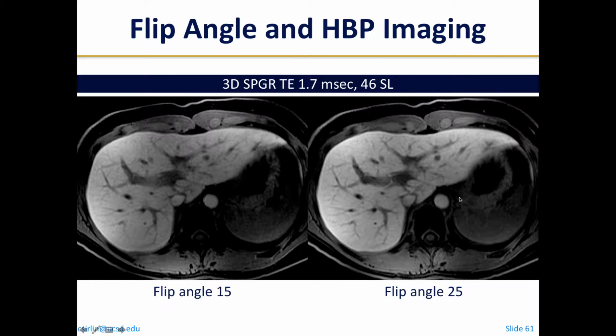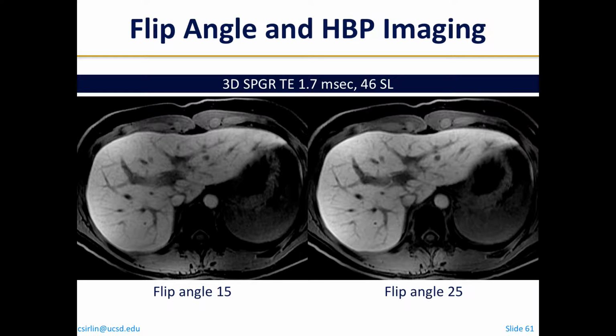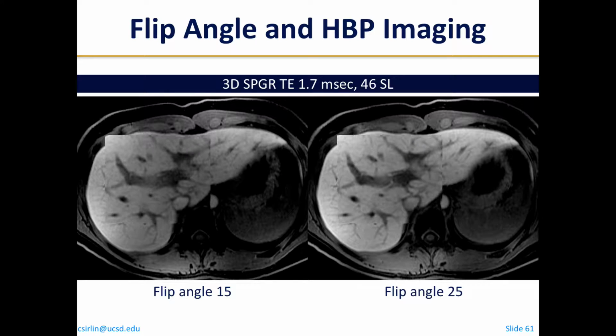What I want to show you now is Dr. Fazeli's favorite organ, which is not the liver, but it's a little structure within the liver. I want to show you that although increasing the flip angle beyond 10 might decrease the signal to noise, increasing the flip angle might increase your T1 weighting. And so to show that, we gave this volunteer EOVIST. And what I want to magnify now is the bile duct.